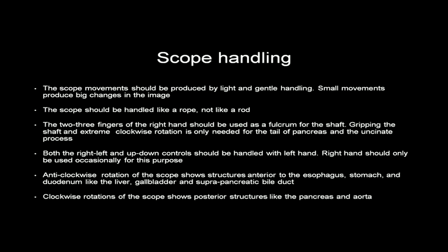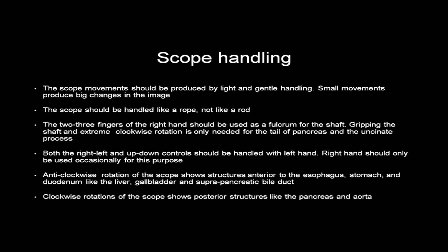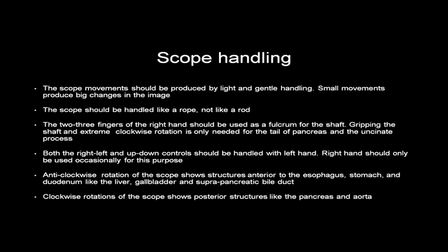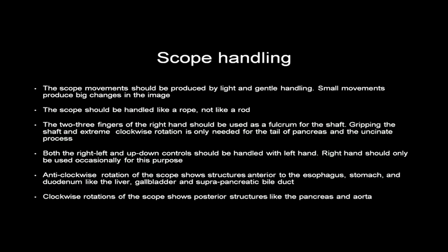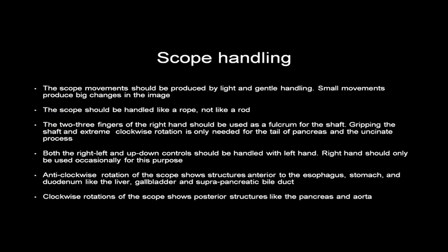The general rule is that anti-clockwise rotation of the scope shows structures anterior to the esophagus, like the liver, gallbladder, and suprapancreatic bile duct, while clockwise rotation of the scope shows posterior structures like the pancreas and the aorta.